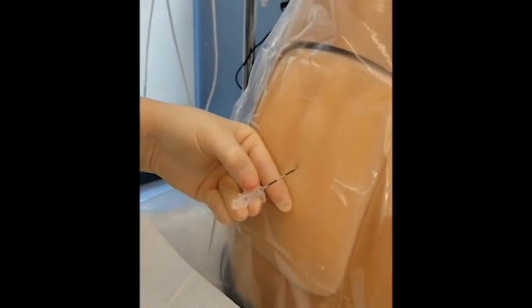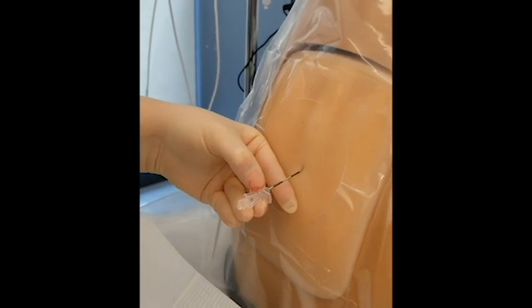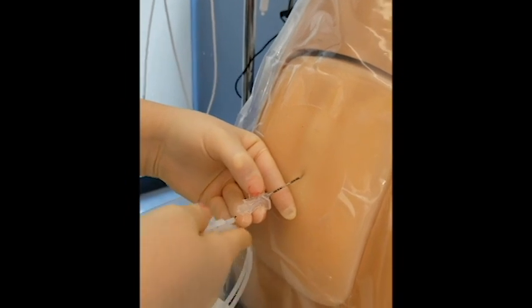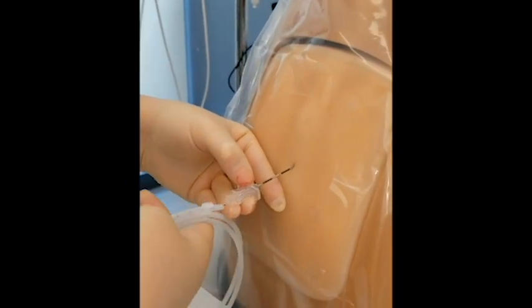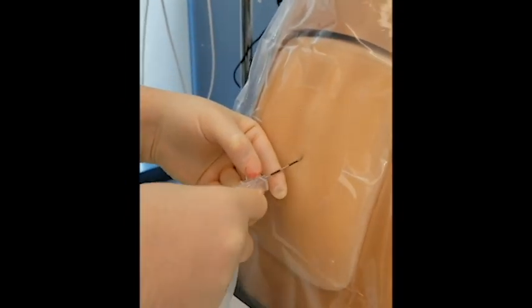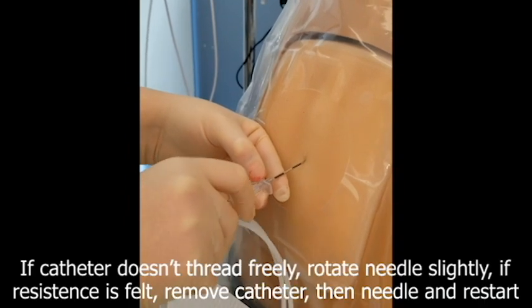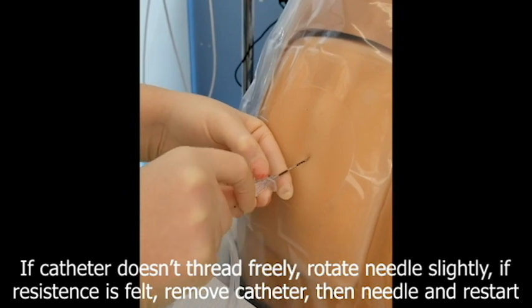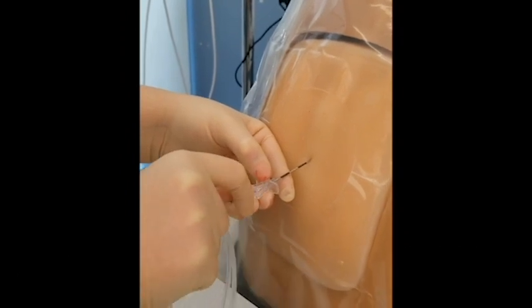Insert epidural catheter into the needle until the 20 centimeter line is at the end of the epidural needle. Again, this is 4 lines on the catheter. The catheter should slide in very easily.